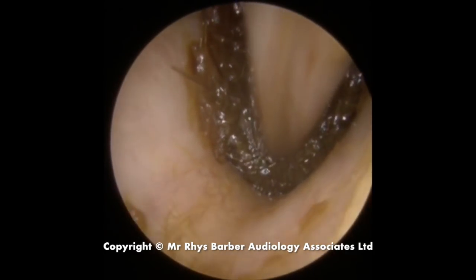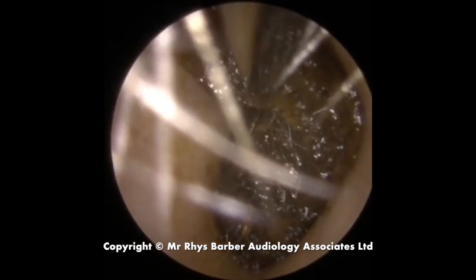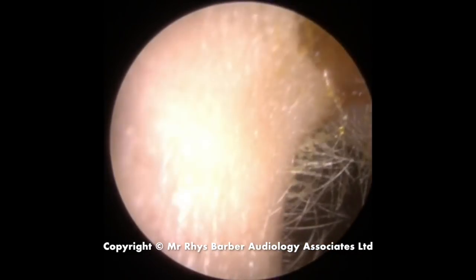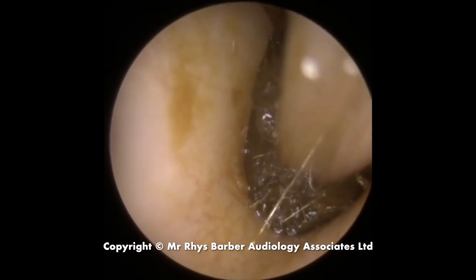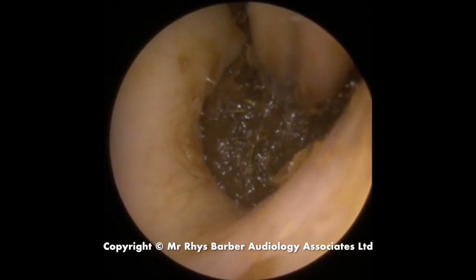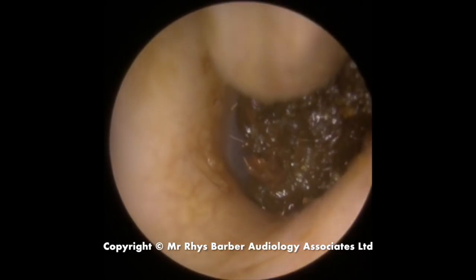The first thing we're going to do is try and detach this wax from the edges of the canal, because it means we're more likely to get the centre mass of wax then moving down the canal in one large piece. I've just broken the first piece away there. You can see the wax is wedged quite firmly in this ear canal. There we are, just starting to see it break down a little bit.